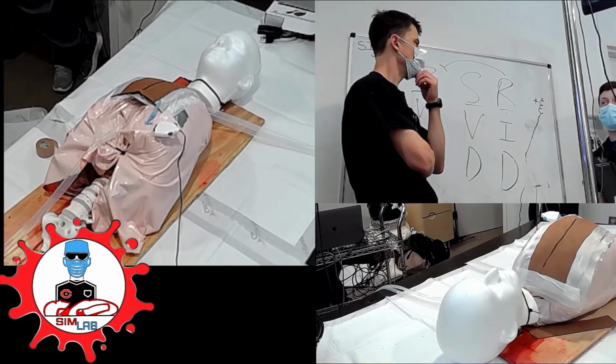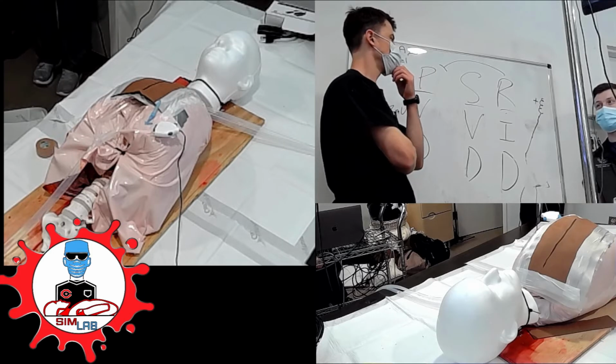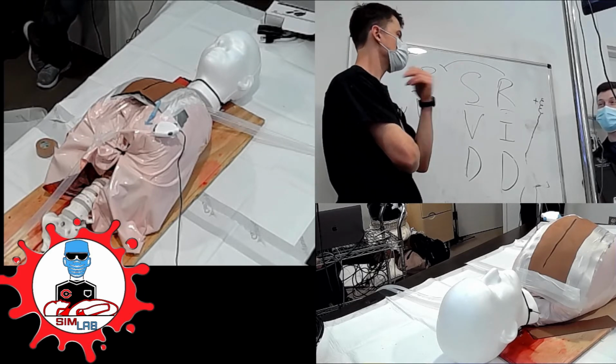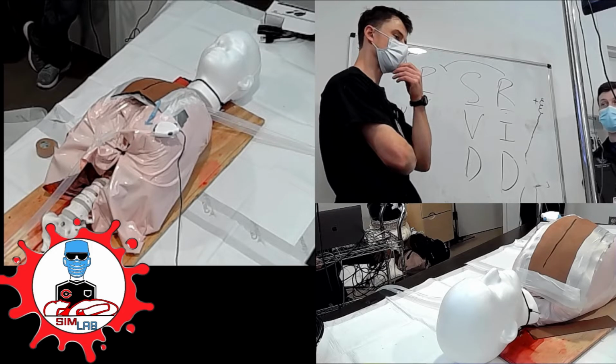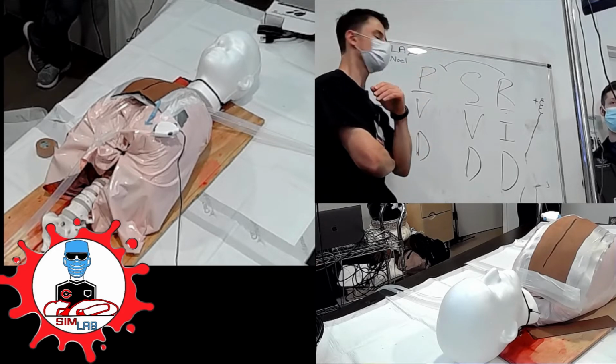So Dr. Noel, what's your next step? You make this work at 2 a.m. Do you then just move to transvenous, not trusting this? That's what I would do, because this is really a temporary thing. These are all temporary things. The patient's going to need a more secure way of pacing. So yeah, that's what I would do.